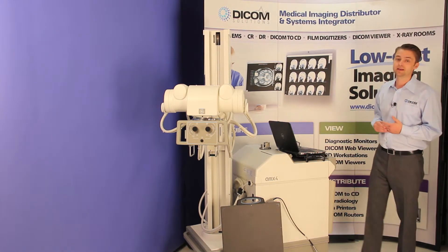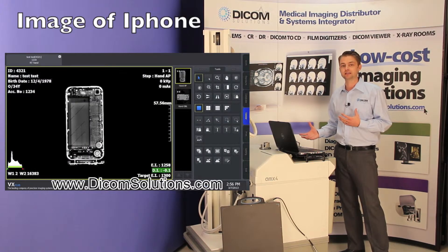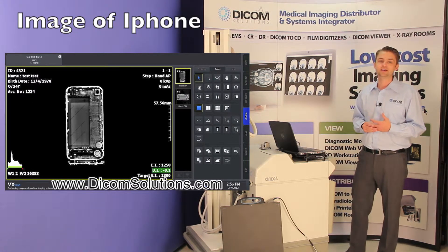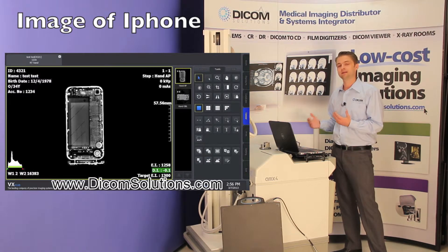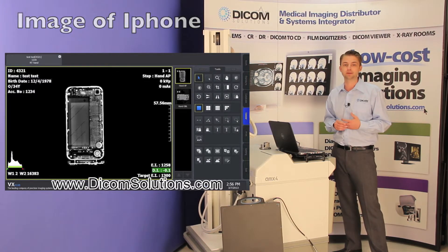The software that is included within here will give you the acquisition software to be able to manipulate the images if need be. So when you acquire the image using the digital detector, you can then see it immediately here up on the screen, choose whether or not you want to use it as an x-ray, and then store it in the local PACS or send it to your hospital or imaging facility's PACS.